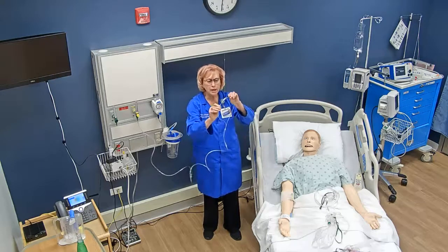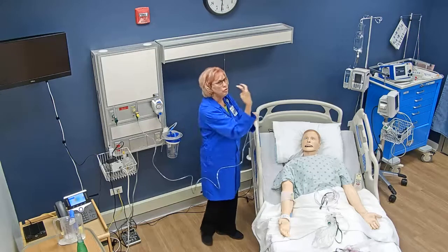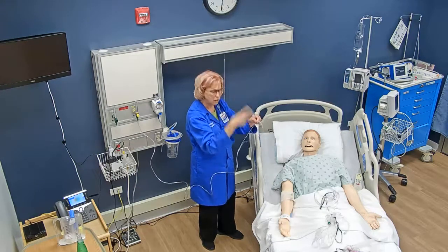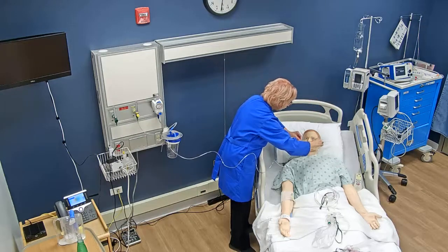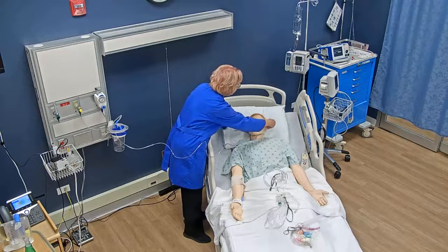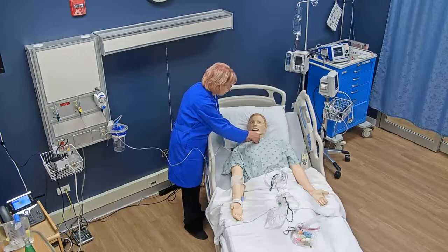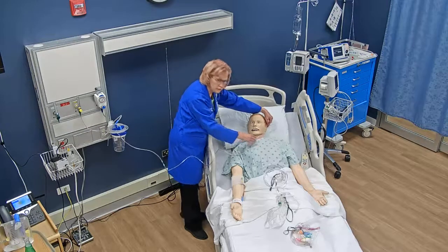I'm going to put the device on my patient. The prongs are shaped so they go into the nose facing in and down — not pointing upward. So I put it into the nose and loop it around the ears. There's a little slide that I can adjust so it fits properly and stays in place.